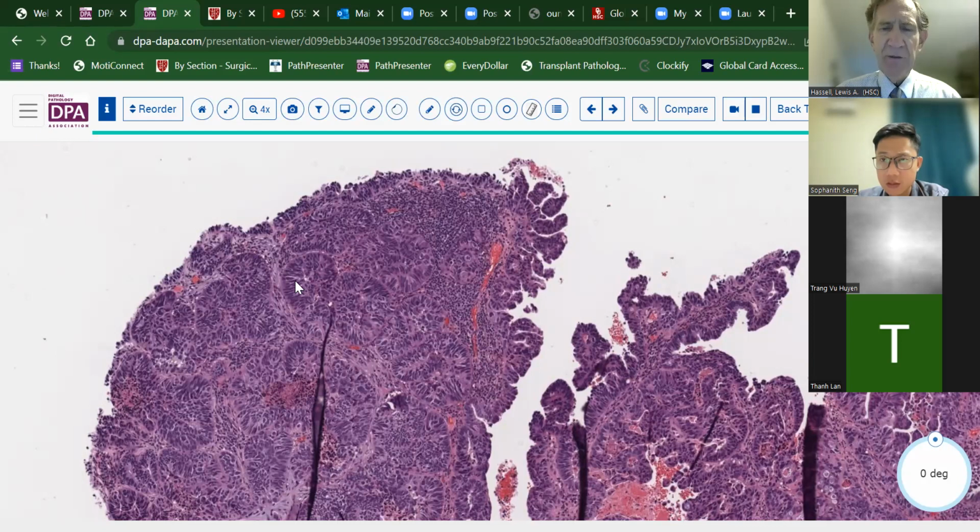So as you know, there are several types of mutations that can be manifest differently in p53 staining. And so the null type of pattern, where you have no cells positive in your tumor, can be easily missed or misinterpreted if you have a few scattered stromal cells and otherwise that are lighting up.